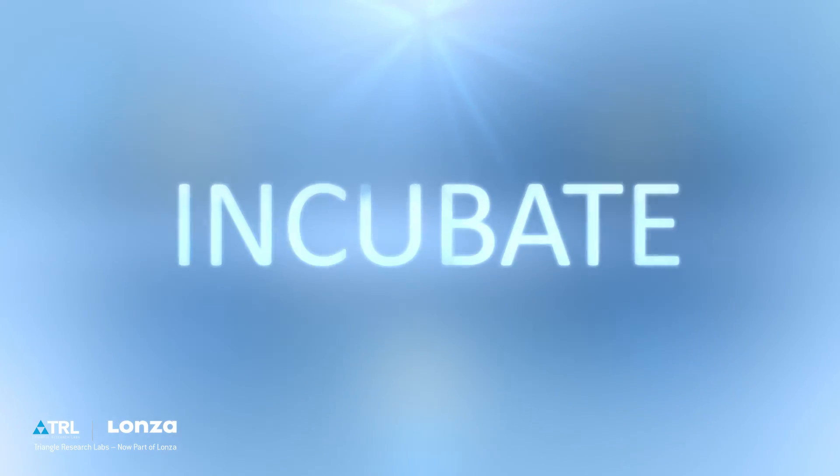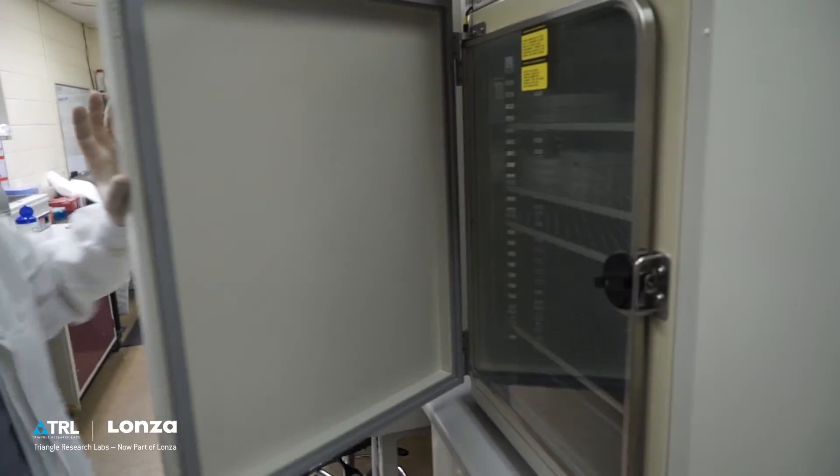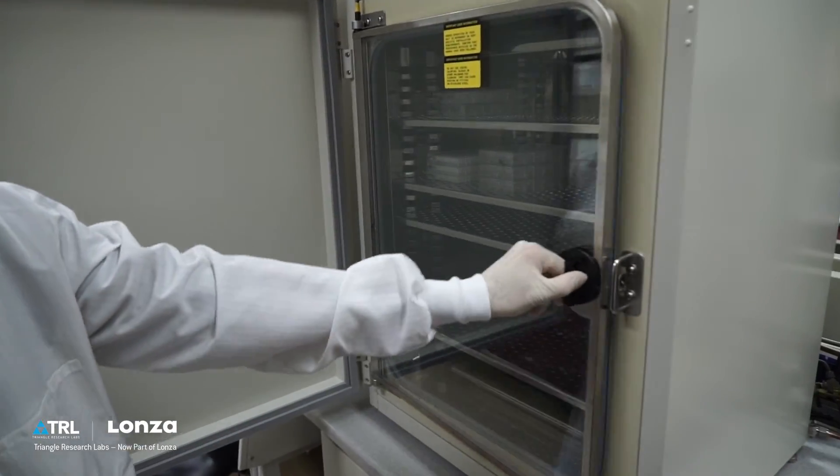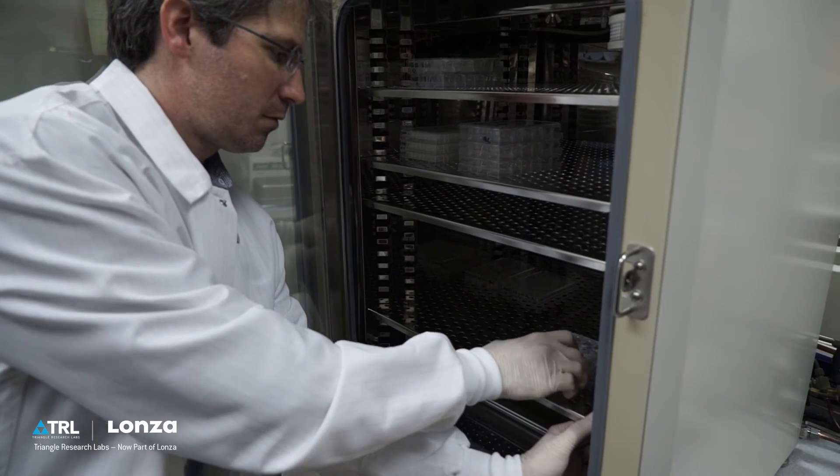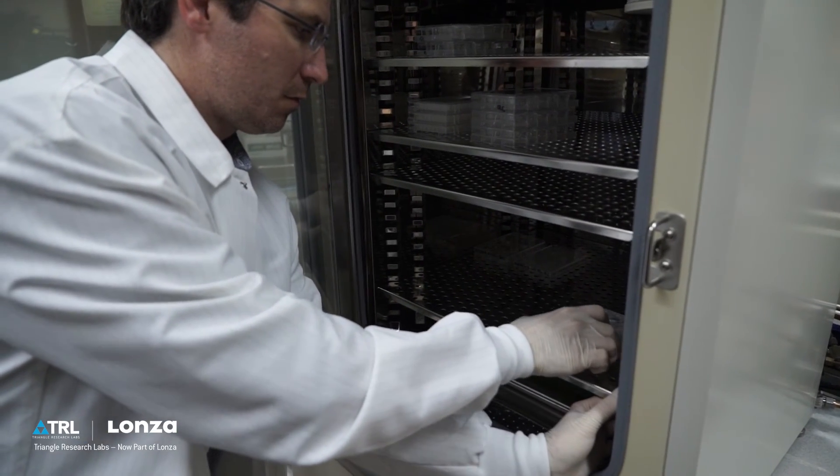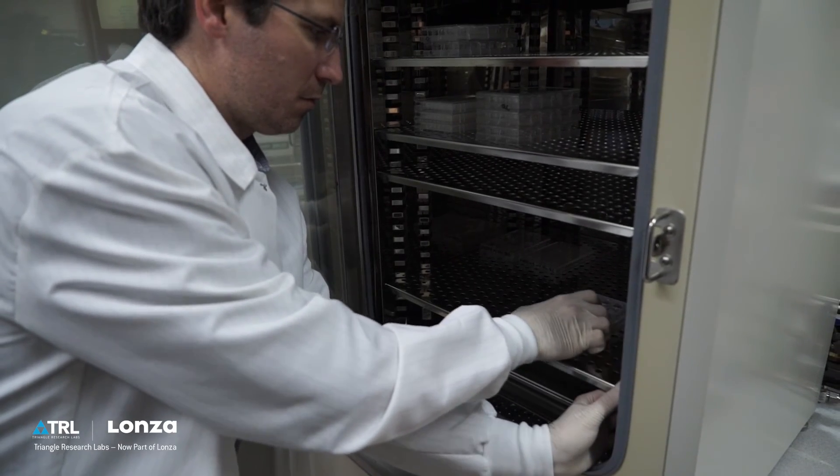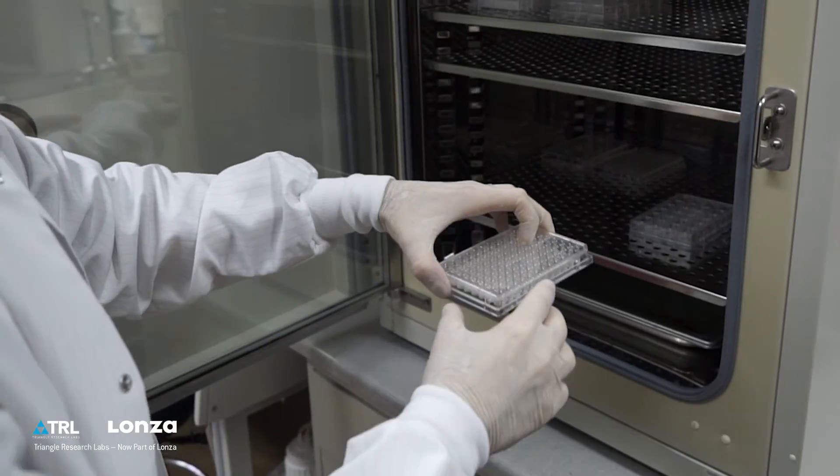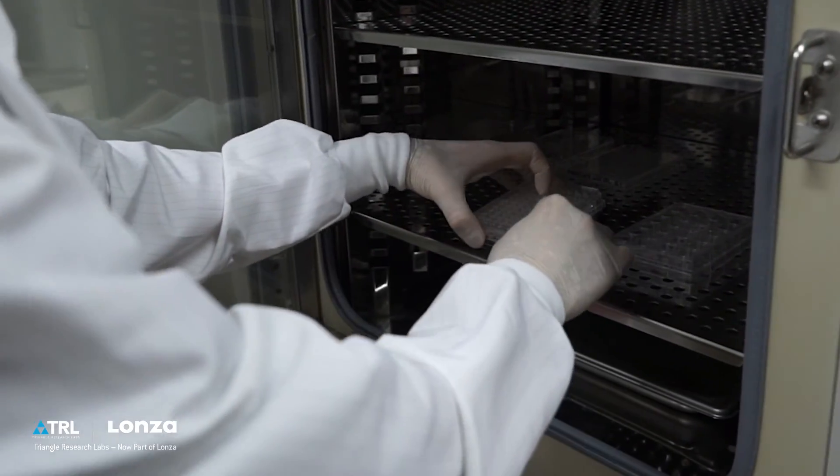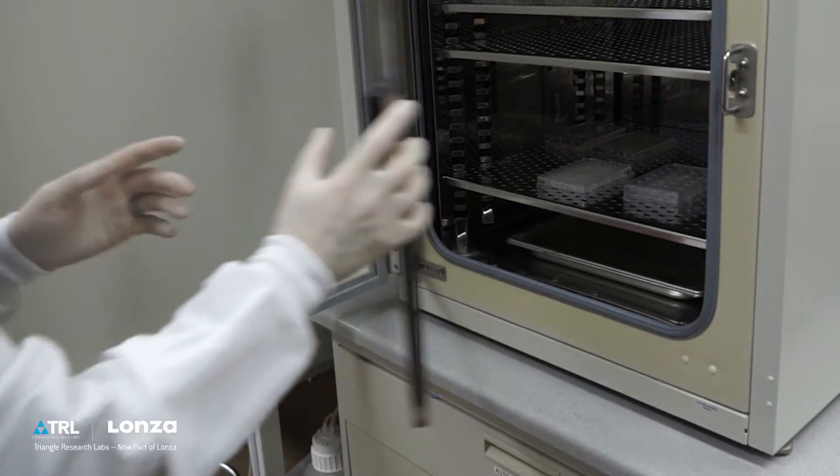Incubate. Place plate in the incubator. Disperse the cells by placing your hands on top of the plate and moving it in a north-south-east-west motion. Repeat the shaking motion at 15, 30, and 45 minutes post-seeding. It is important to note that a 96-well plate must be carefully placed into the incubator area and does not require any shaking.